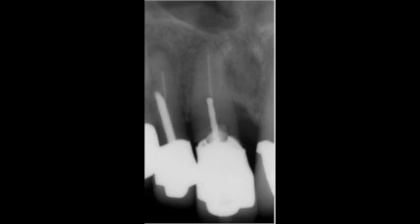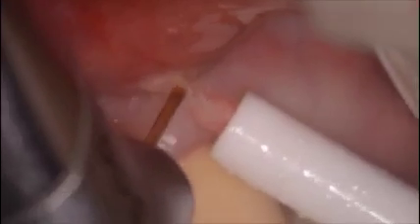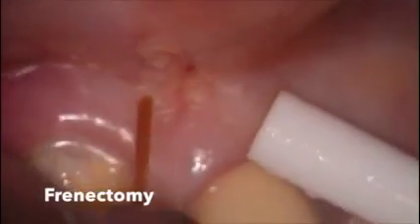This tooth has a failing endodontic problem, and first we decided to do some tissue plasty and a frenectomy. You can see here we're using 2.5 watts, 50 hertz with an MZ5 tip to just remove some tissue on the frenum. We're then going to do a frenectomy to allow for greater movement of the lip and to release the frenum. We're using the same tip and same settings, doing a very small frenal release.